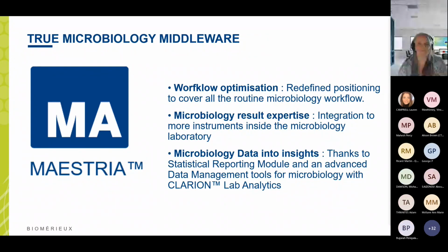So we've got MAESTRIA is a brand new middleware for microbiology, a true middleware.